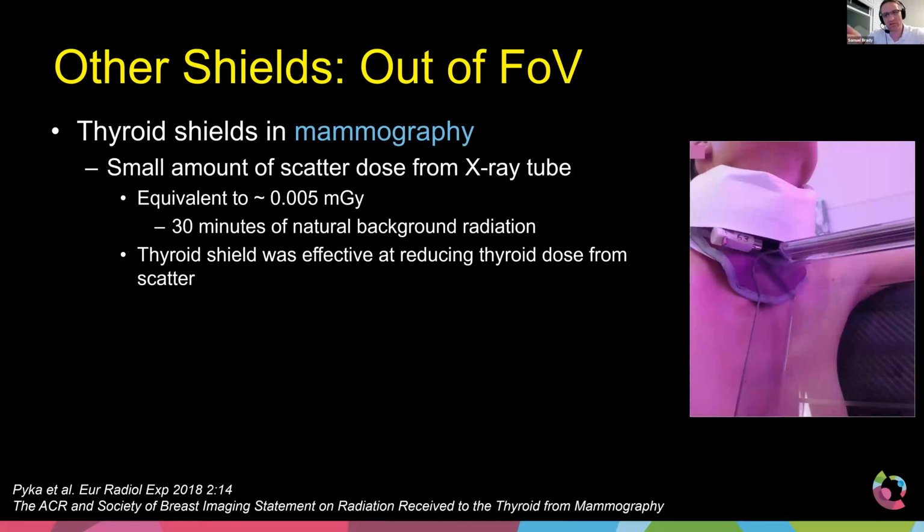All right, still talking out of field imaging. So now let's talk mammography. About 10 years ago here in the US, we had one of those medical doctors that is a talk show host. He has a talk show every afternoon and he gives medical advice to everyone. And for whatever genius reason, he said, hey, if you're going to go get a mammogram, you should wear a thyroid shield. And then overnight, all of these women going in to get mammograms immediately started demanding thyroid shields. So various different organizations, mostly the Society of Breast Imaging, the people that deal with imaging and mammography every day, had to finally come out and say, listen.